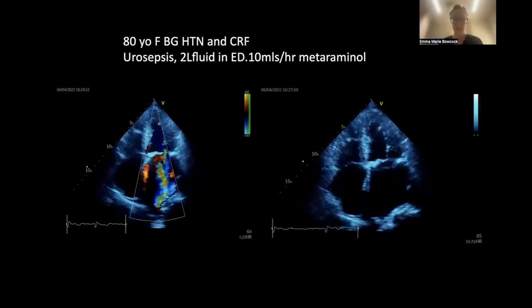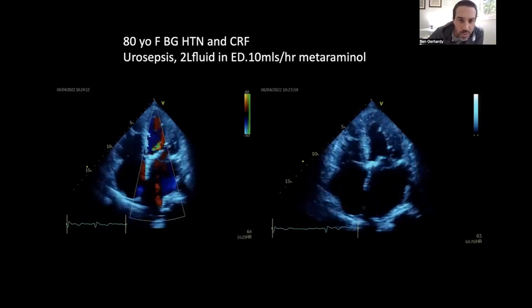Very nice, Ben. Let's play this one. Now, what color Doppler scale is at 60.